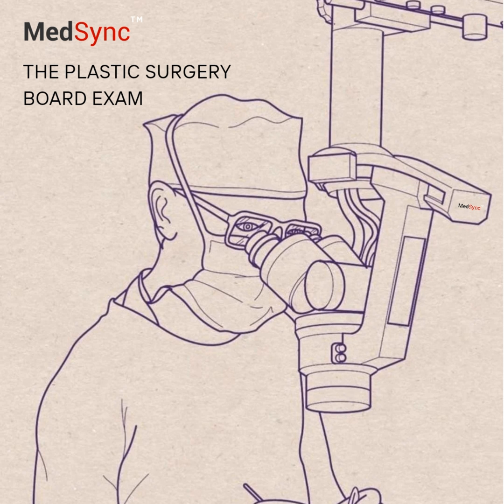Let's talk skin grafting specifically. How does NPWT help there? It's a fantastic tool for bolstering skin grafts. The foam contours perfectly to the wound bed, ensuring intimate contact between the graft and the bed. Applies even pressure, minimizes shear forces and fluid collection underneath. Especially useful for tricky areas. Exactly. Difficult contours, large grafts. It actively pulls the graft down, promoting that initial vascular connection and inosculation. If you fenestrate the graft, NPWT pulls serum or blood through the holes.